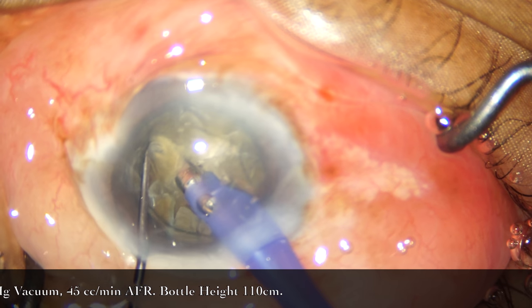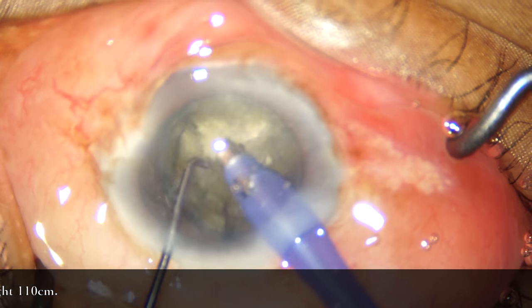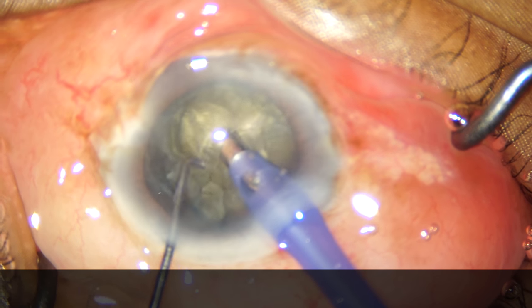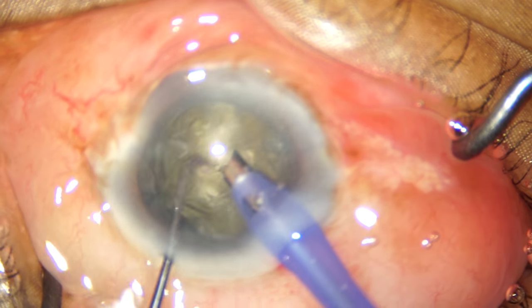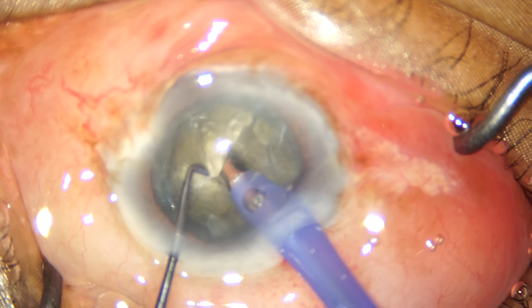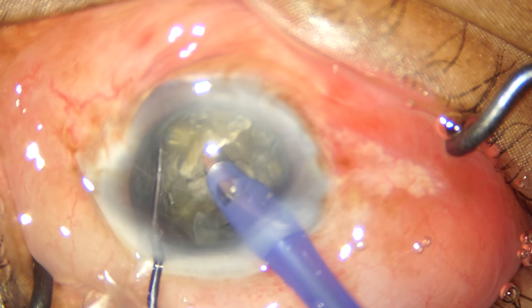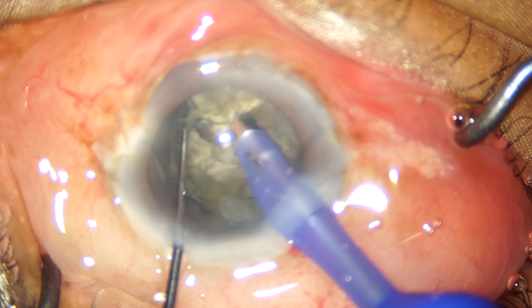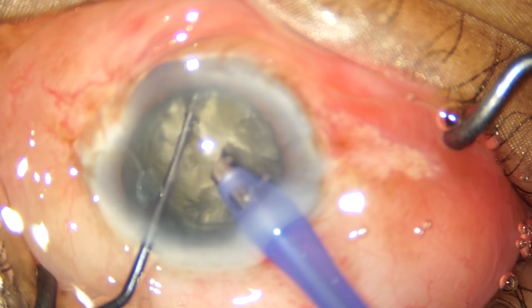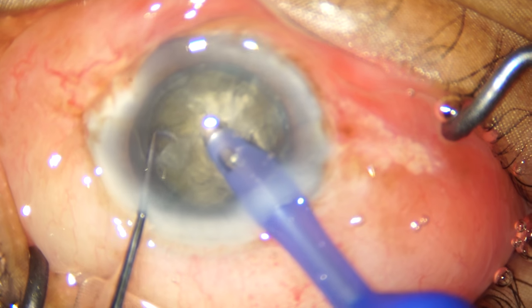After failing in our first attempt, we rotated the nucleus slightly and are trying again from a separate place. If you do not get a complete chop in the first attempt, rotation of the nucleus is the key, and attempting another chop from a different place is the way to go about it.